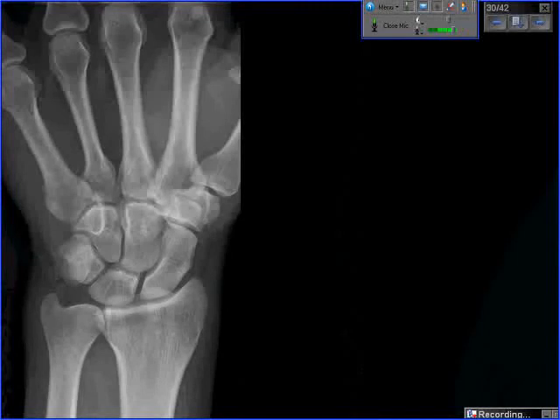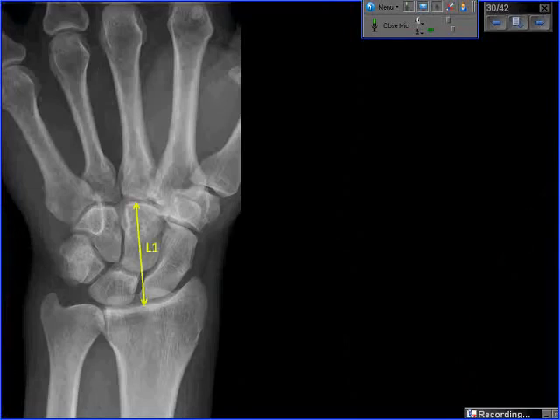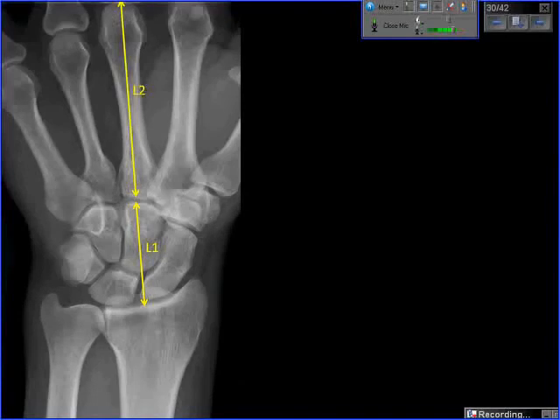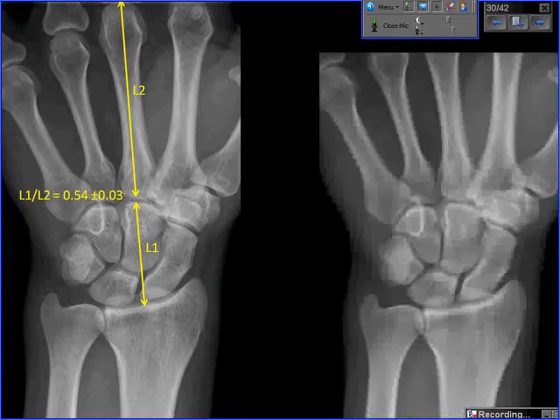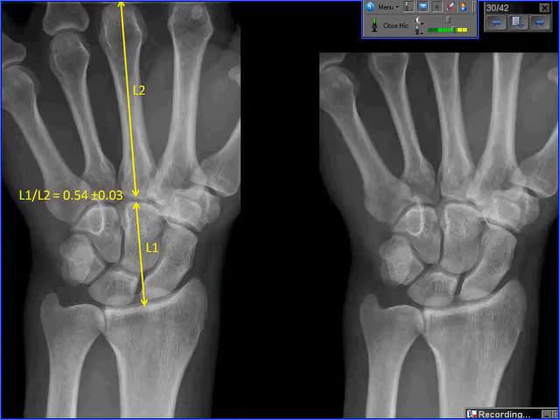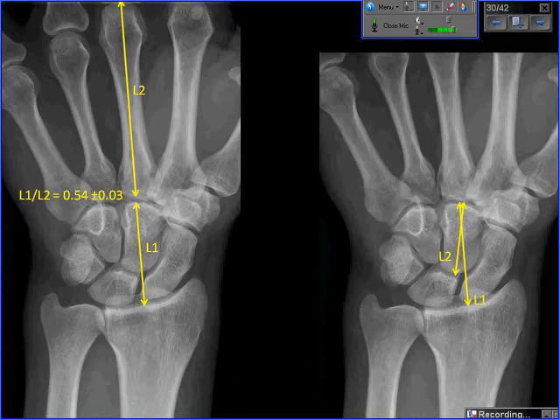To assess whether the carpus is reduced in height, the carpal height ratio is measured as the distance between the distal radius and distal capitate divided by the length of the third metacarpal — normally around 0.54. When the third metacarpal is cut off, an alternate method divides the carpal height by the capitate height along its axis, which should be around 1.57. By inspection, this carpus is clearly diminished in height compared to the normal side.